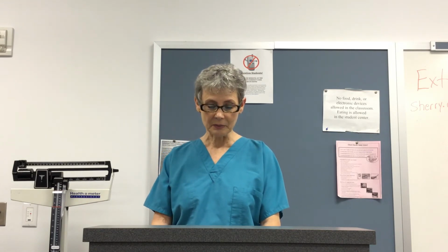You'll have to encourage your patient to move that arm the least amount possible. If it becomes a real problem, especially for the patient and they just cannot get any sleep, it is really a high stress for them, consider taking it out and starting a new one.